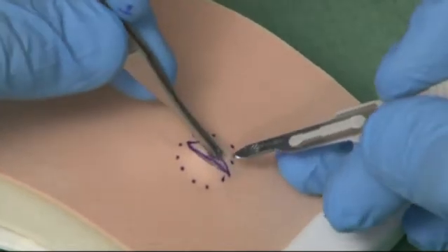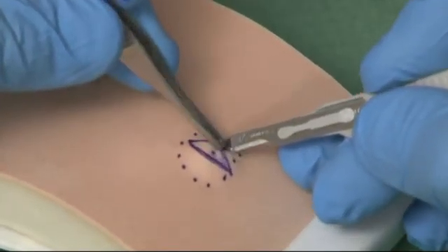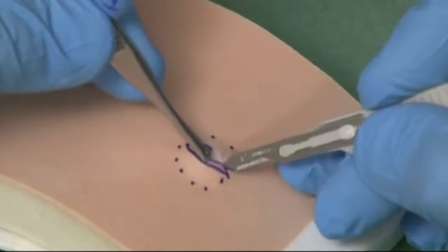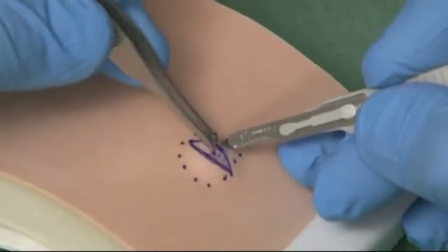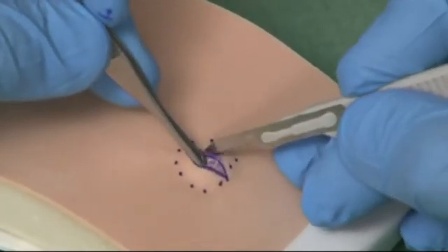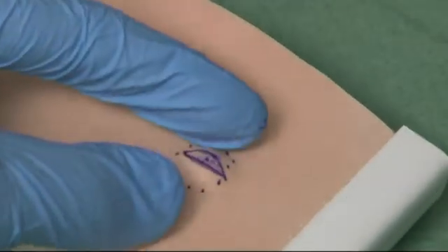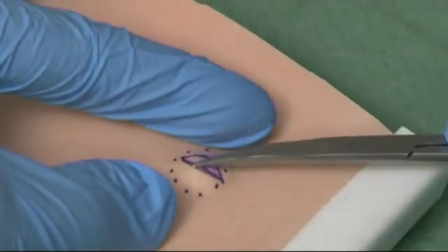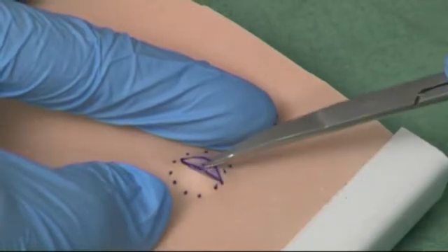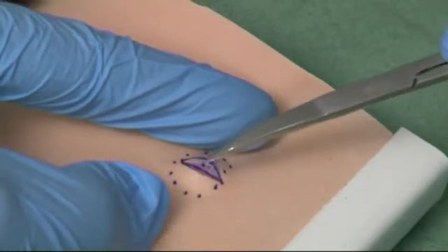Then, using the tooth forceps, find the plane in which you will blunt dissect. Using blunt dissection, the cyst wall is separated from the surrounding tissues.